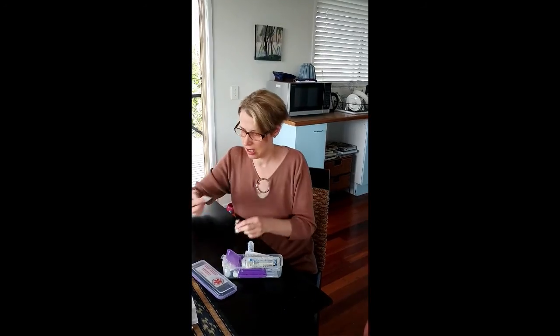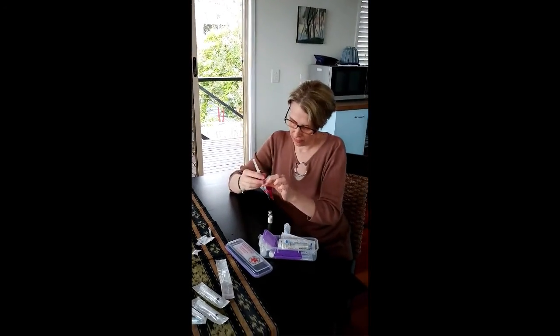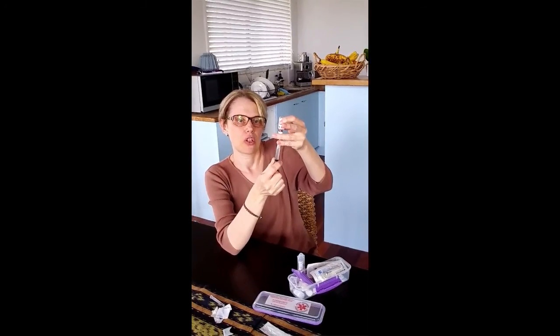You can see there are no pieces floating in it. Remove the cap from the syringe and draw up two mils of air — it does help. Bring the needle down so that you are actually in the fluid. Because of the air, you can see it pulling down; the air gives pressure to fill the syringe automatically. For the last little bit you do need to pull down yourself, keeping the syringe down so you're in the solution to get it all.